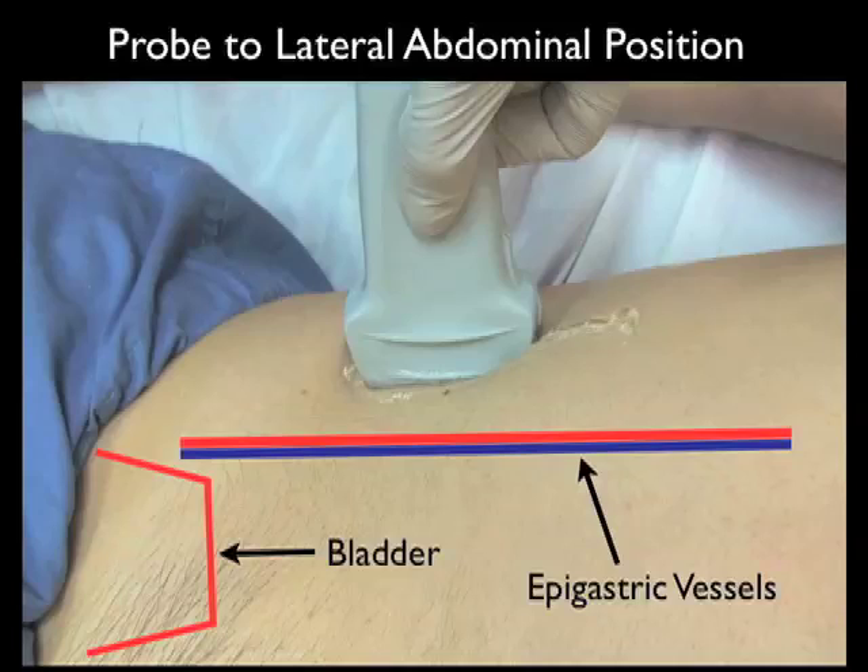We can see here that the probe is safely lateral to most of these structures. Thus, a paracentesis can be safely performed from this position on the abdominal wall.